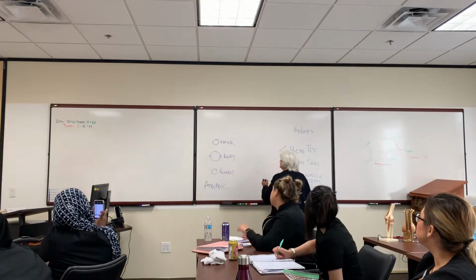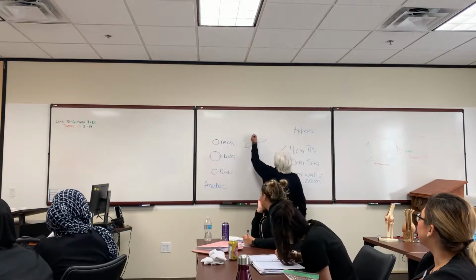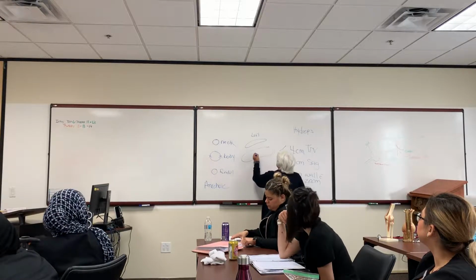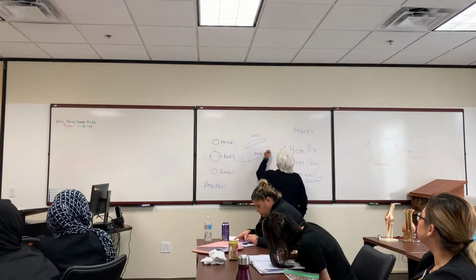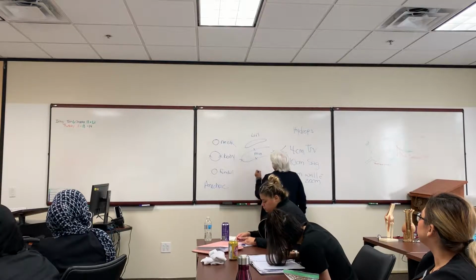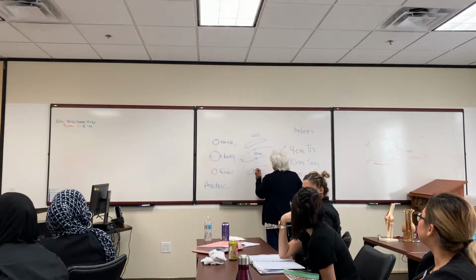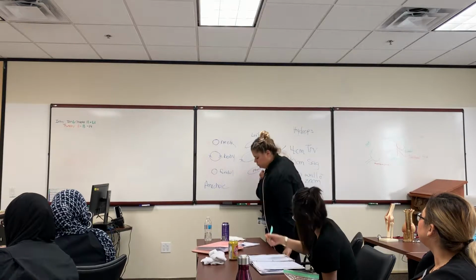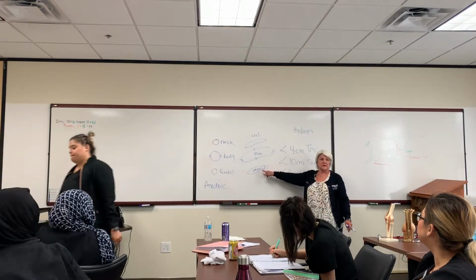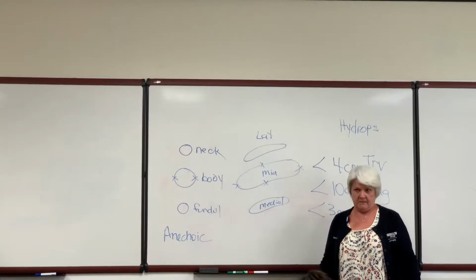Okay? So, this is what it's gonna look like. Lateral, mid, with and without measurements, okay, and medial. Okay? I'm not gonna know the difference between medial and lateral unless you tell me.